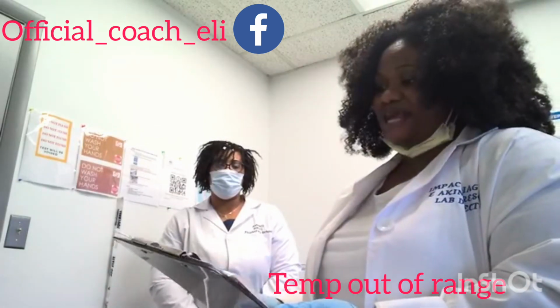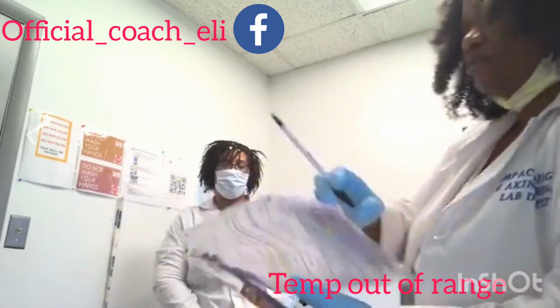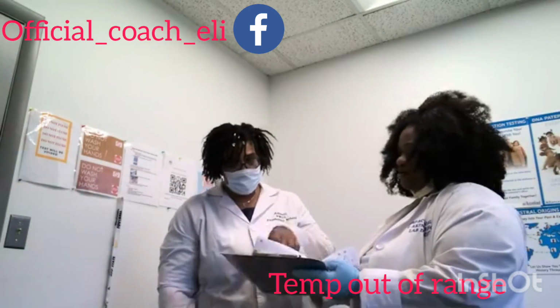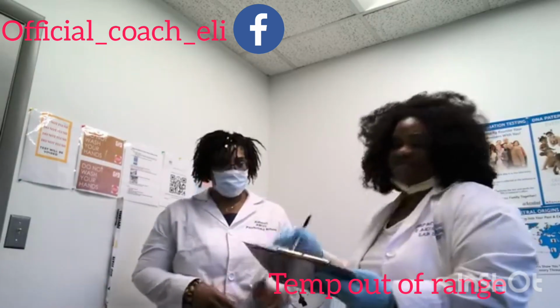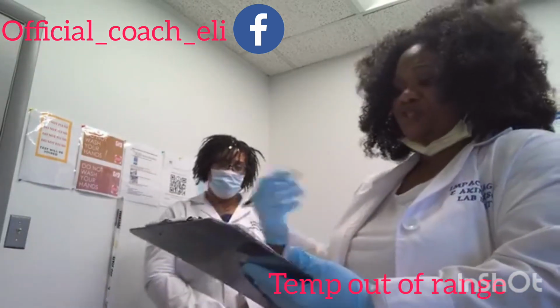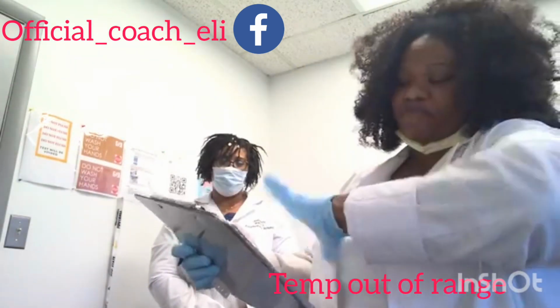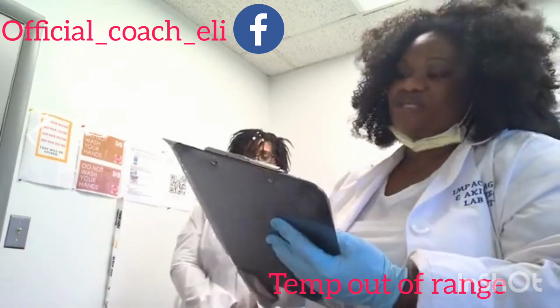And step 3 is asking for the donor to initial on the back of the MRO copy. So Miss Ashanti, could you please sign your name, your phone number, your date of birth, today's date, and all this information? Yes. Perfect. Once that's done, I'm going to go back to the first page, the lab copy, right? And I am going to go ahead and sign as the collector on step 4. I'm going to put my name, I'm going to put the date and the collection time, and that's 1:16 p.m., and I'm going to tell where I'm releasing the bottles to.